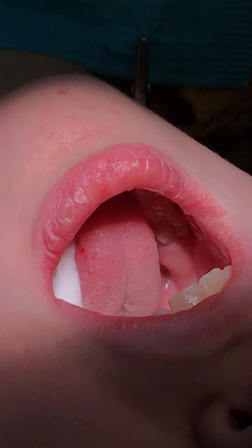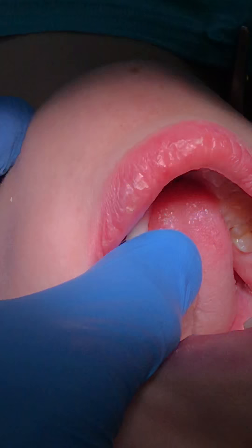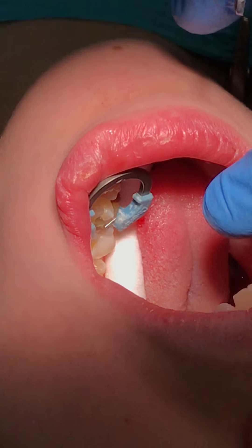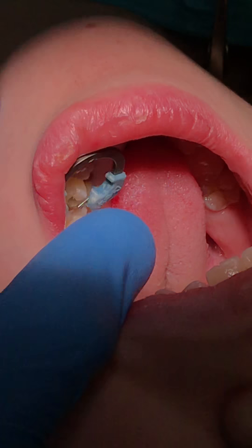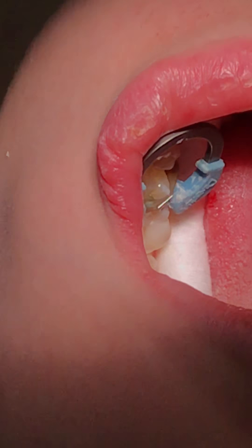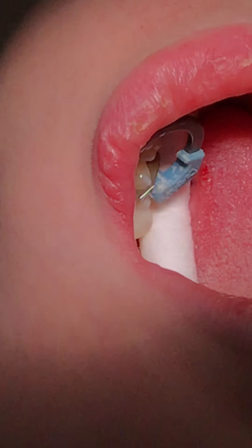This system is really fantastic for getting a nice tight contact, and then we use this ring — you can feel some pressure with this. The ring goes over like so. We got primary separation with the wedge, but with the ring we get even more separation. That's looking really great and then we can proceed. We've got a nice dry field going with our adhesion — our Peak — and because this is a little deep I'm going to put a little bit of glass ionomer there.